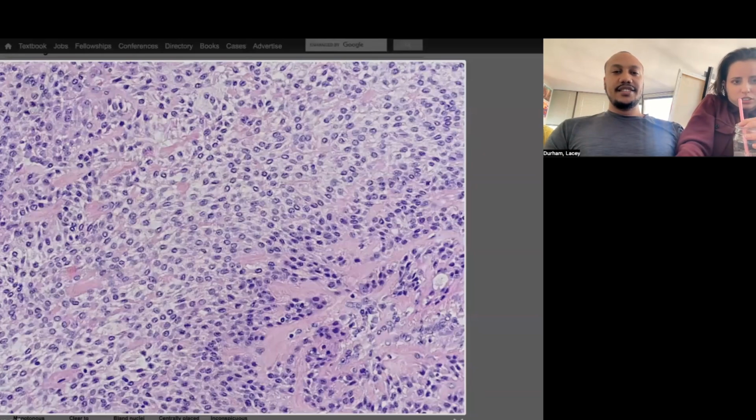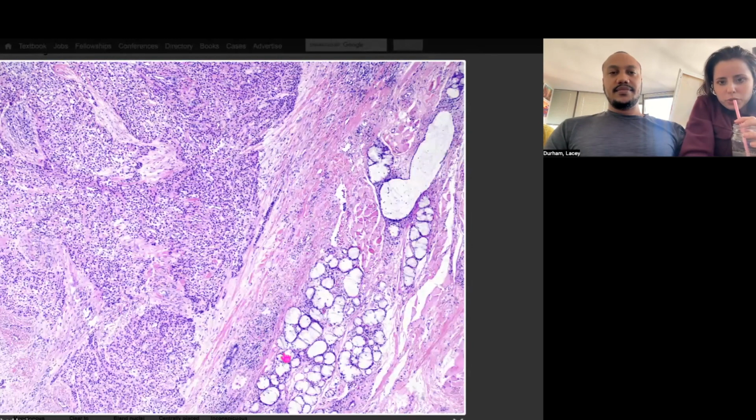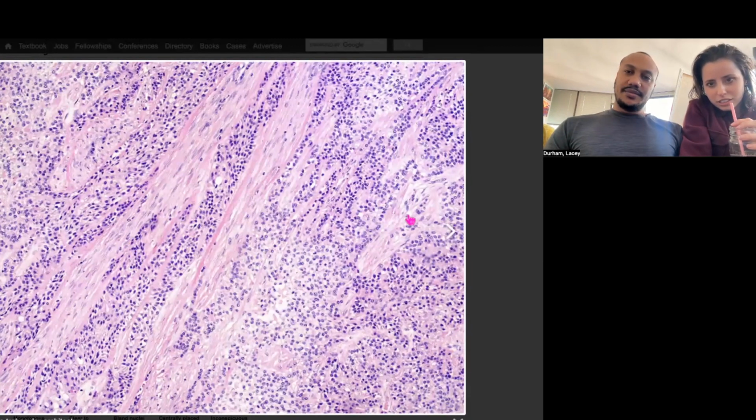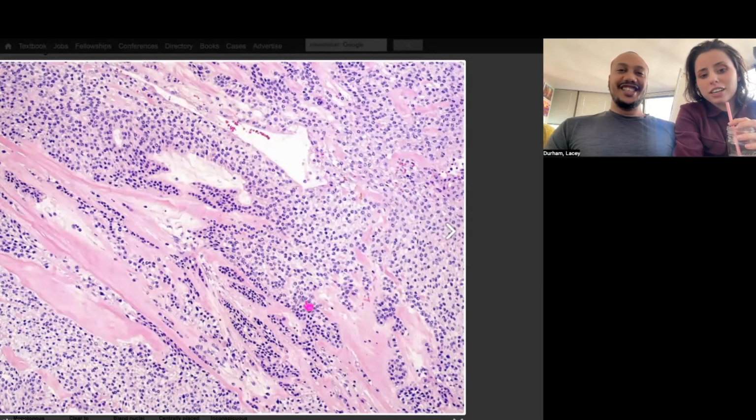Can you go through some pictures? Is this the hyalinizing part? Is this the clear cell part? This is the hyalinizing part? That's a nerve. I don't think so. This is the hyalinizing part. I definitely think that. And then this is the clear cell part. This also looks like a glomus tumor. Does it not? Except I feel like in glomus tumors, the nuclei would be dead center in all of these.